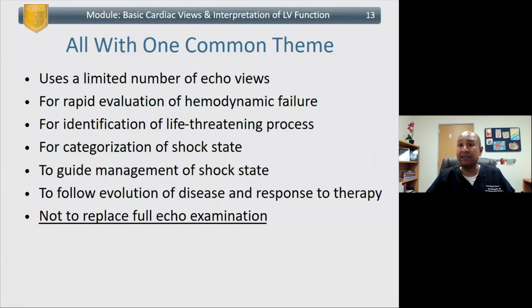But by no means is doing a basic echo going to replace getting a full echo exam done by a cardiologist or someone who is certified in doing echocardiography.